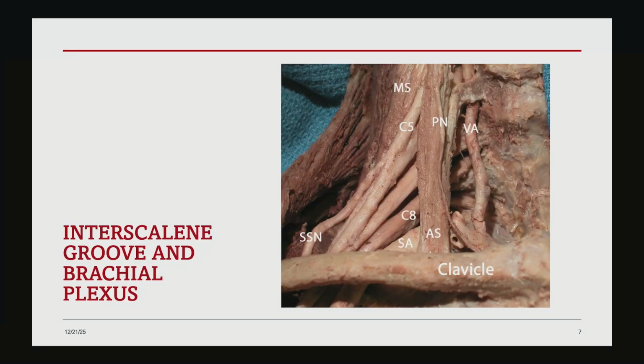crani, posterior and lateral. So when we see the subclavian artery and trace above, we'll be able to see the interscalene groove. That is the trace back technique. Another very important thing is the phrenic nerve shown here. The phrenic nerve is in very close relationship to the interscalene groove. Another important landmark is the vertebral artery.